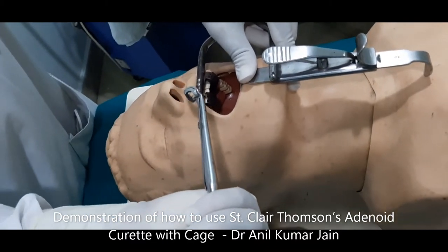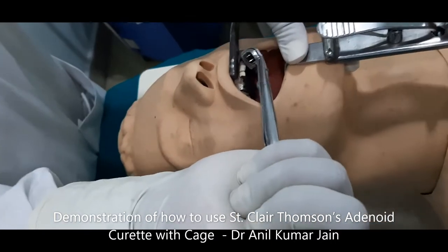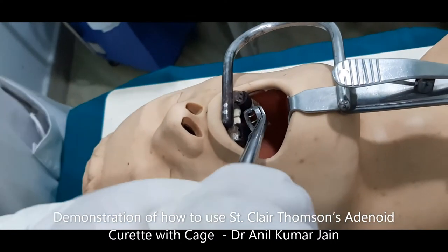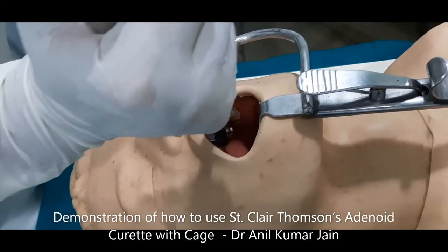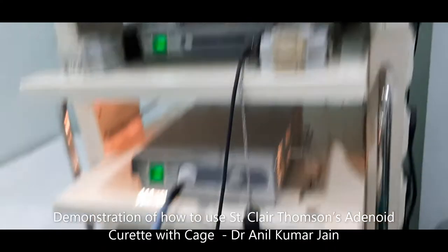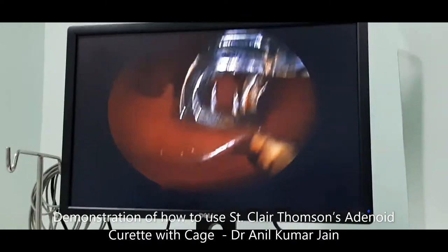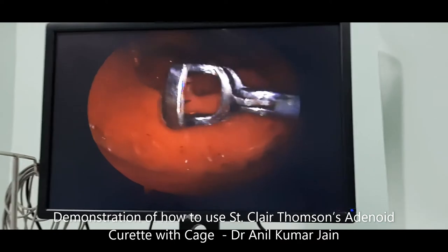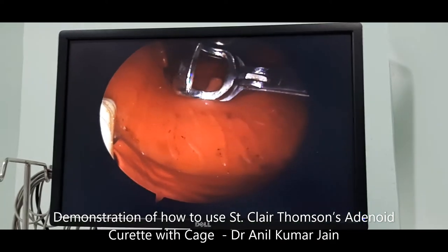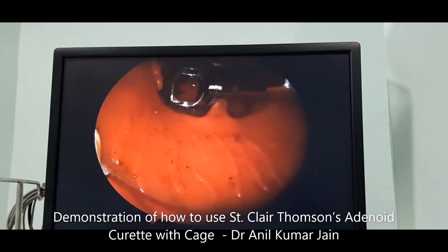Move your St. Claire Thompson's Adenoid Curette with Cage gently in the oral cavity without touching any soft tissue. You can very well see how it is progressing in the oral cavity. Rotate it gently, pass beyond the soft palate and uvula.